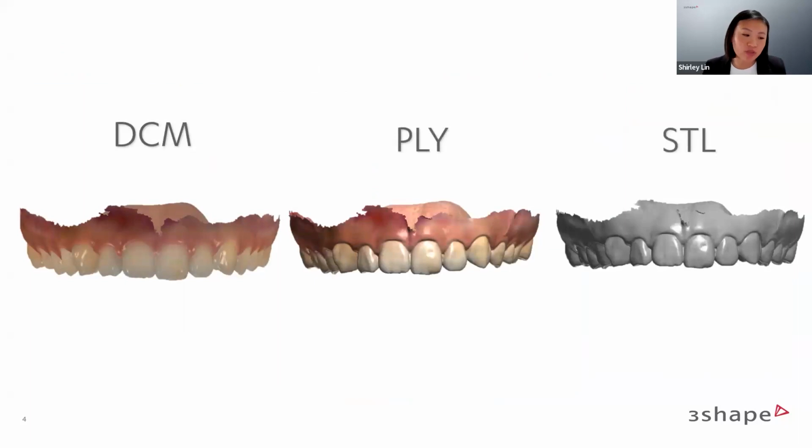But just to highlight, of course, some dentists will still be using some of those materials because you do your in-house retainers or even your mouth guards maybe. So without having to store your stone models, you've got digital impressions stored on your device or backed up on an external hard drive. Much like digital photos now, you've got them all stored on your phones and your computers instead of having a whole photo album.